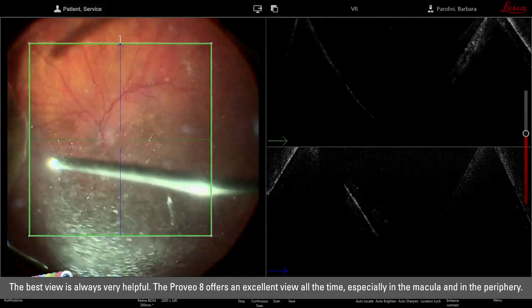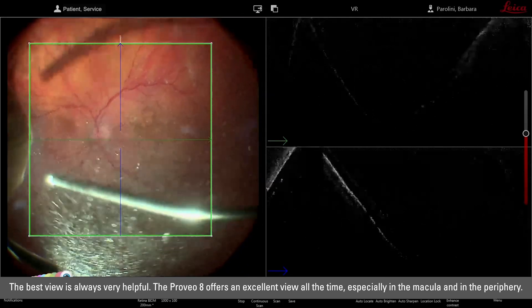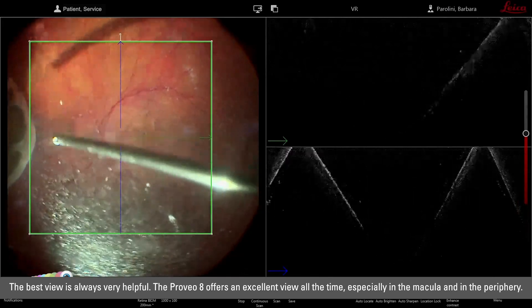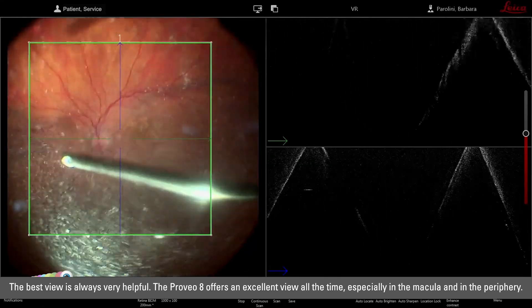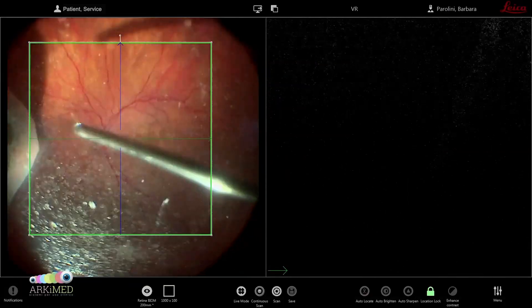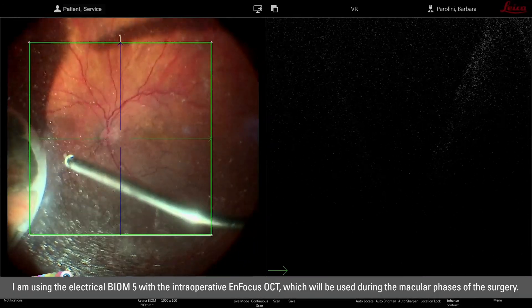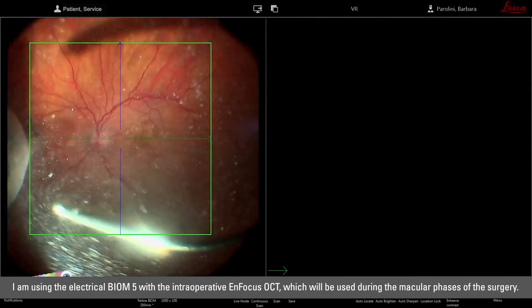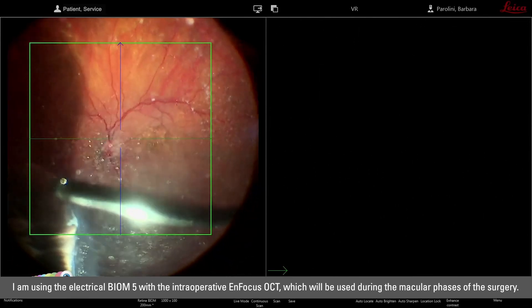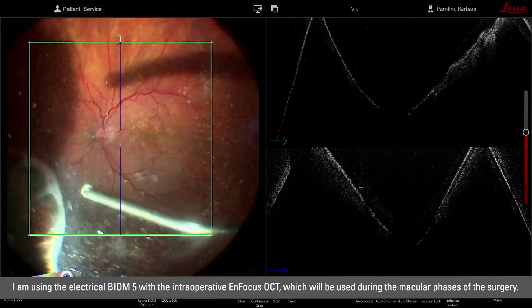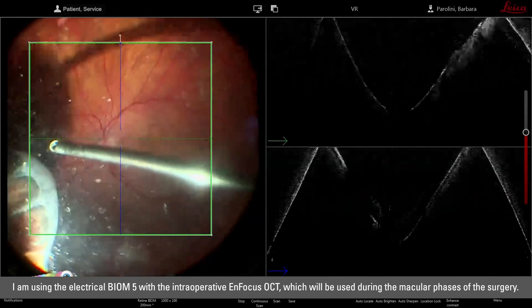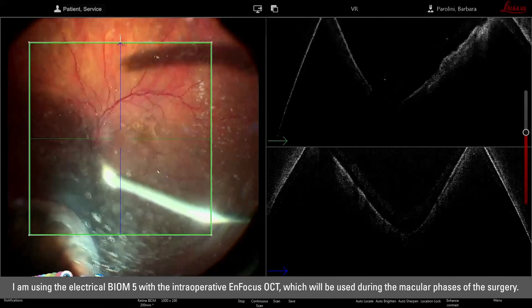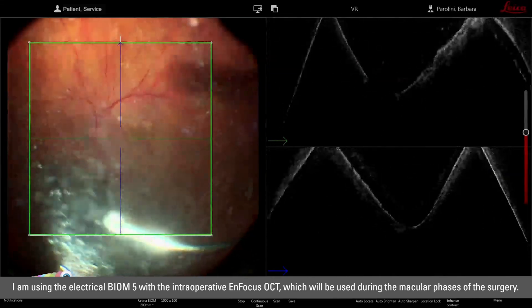The best view is always very helpful and the microscope Proveo offers an excellent view all the time in the macula and in the periphery. With the microscope Proveo I'm using the biome panoramic viewing system because it allows me to use the in-focus intraoperative OCT that we will use in the macular phases of the surgery.